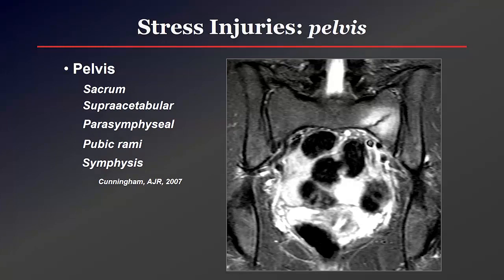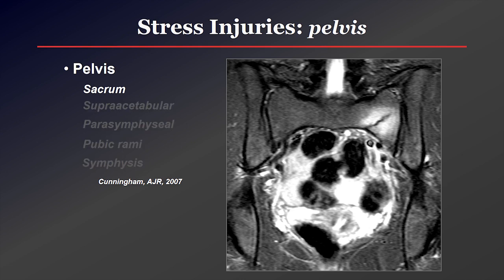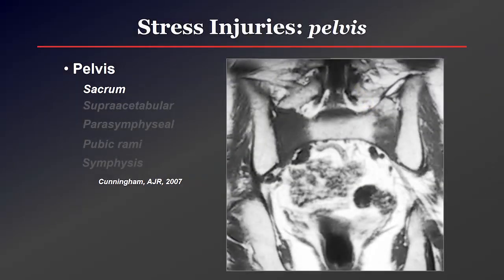Moving to specific sites — it's very important to know where these things occur, because there are usually very reproducible areas for stress injuries, and if you know where to look you have a much higher chance of finding these early. Beginning in the sacrum, these tend to affect the sacral ala. In this 23-year-old runner, you see prominent edema in the left sacral ala with an oblique fracture line. In another patient, a vertical orientation of abnormal signal within the sacral ala suggests a stress reaction. This patient underwent radiation therapy and now has extremely fatty marrow, which is a risk factor for developing insufficiency fractures within the pelvis.